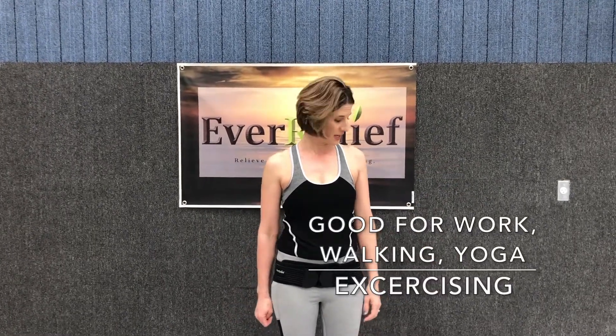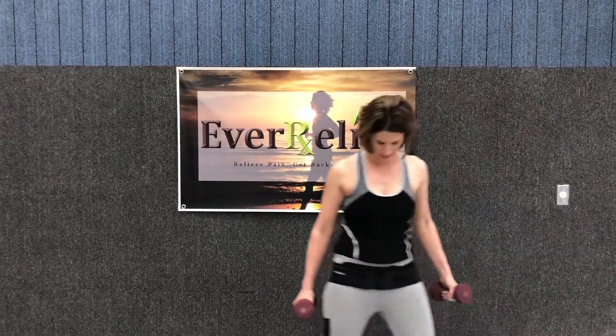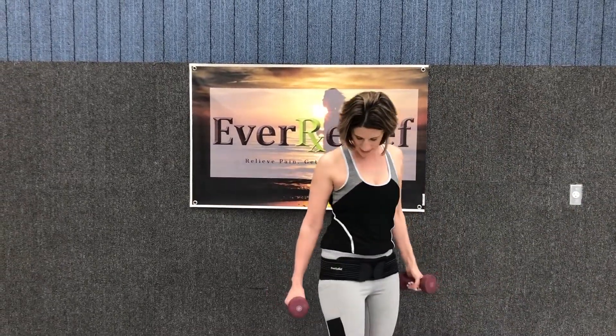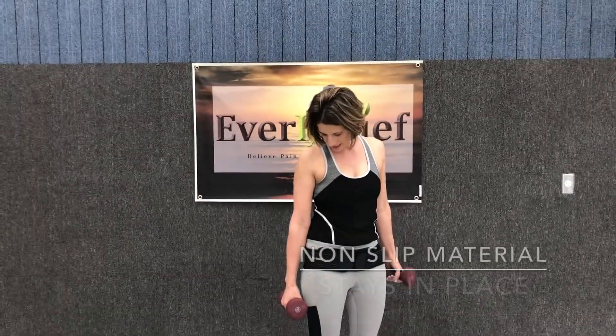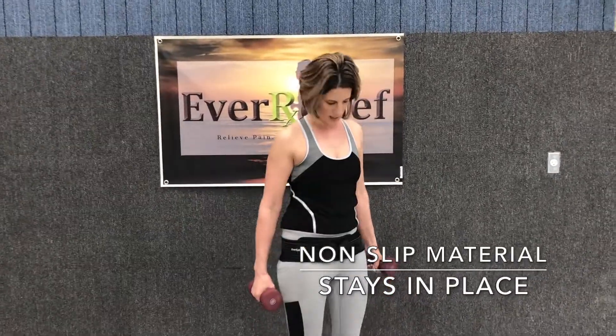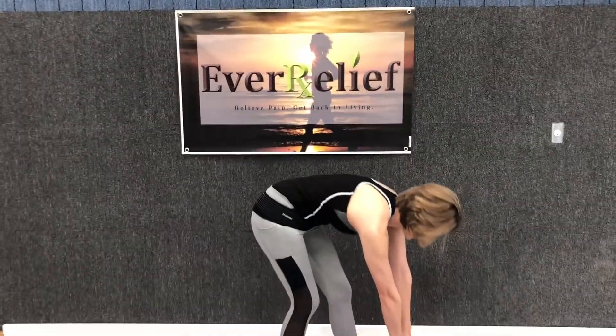This is a great product that can be used for walking, for moving around your house, at work. You can exercise with it on — light exercise is great: yoga, lifting weights. You can see when you're bending, the belt has non-slip material, so it's going to stay in place as you're moving, bending, and stretching.